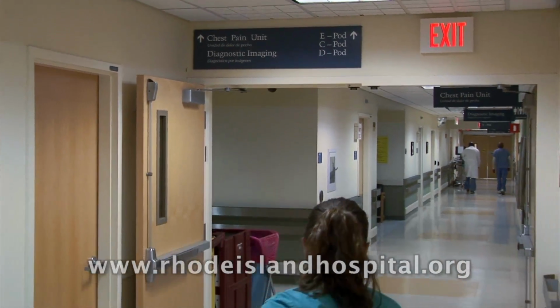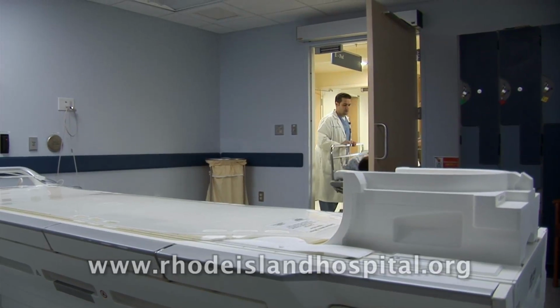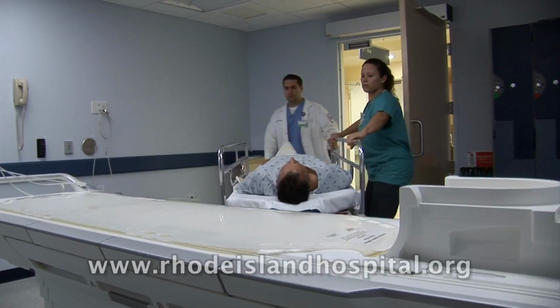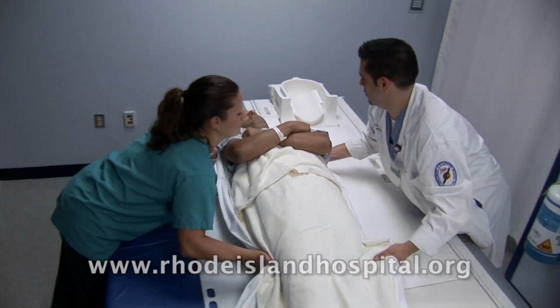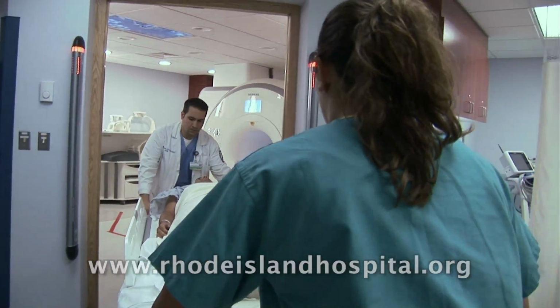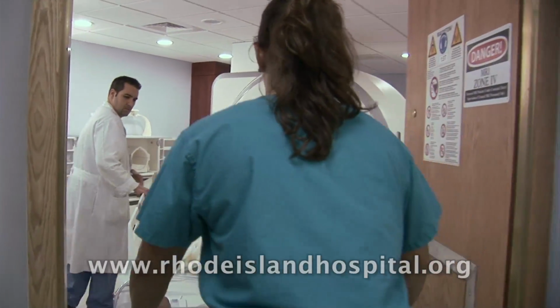Trauma care, particularly in the spine: we had no way of seeing if the spine was injured after a motor vehicle accident, for example. We knew the bone was broken, but was the spine damaged? Did it need surgery or not? MR is the way to make that analysis. And in a pediatric patient or a pregnant patient, for example, whereas we may have chosen a CT scan normally, potentially on a case-by-case basis, we would choose the MRI.